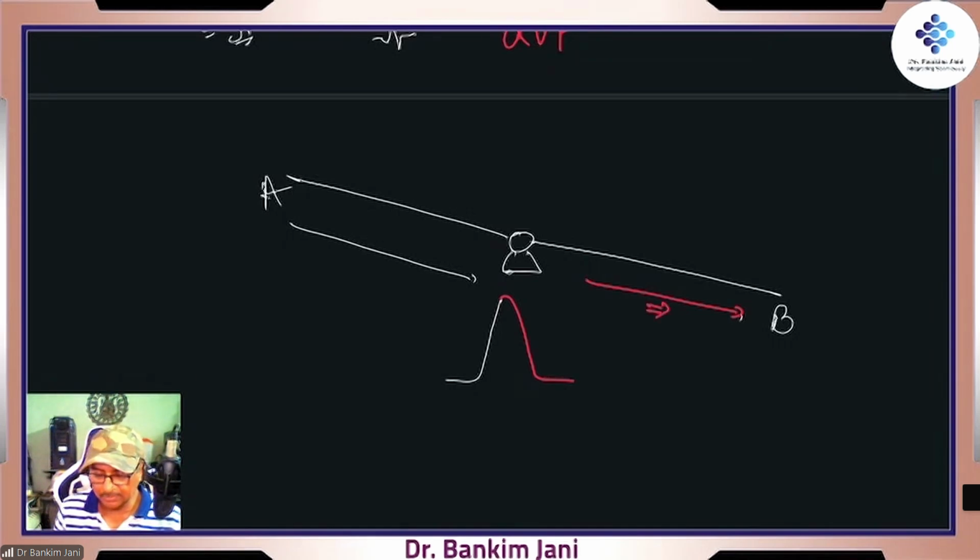Because it is going away, it is going down. As it comes near, it is up. So positive and negative deflection are simply telling us one thing: whether the signal is coming or going with respect to this point.